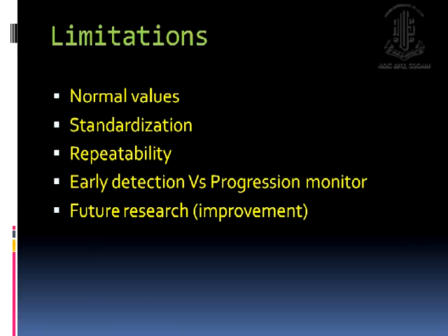There are some limitations in general for the multifocal testing. Number one is the normal values. There's a big range of normal values, even centrally and peripherally. That's why it's a little bit more difficult to standardize the test. All that's available now is guidelines from the ISCEV, and it's very hard, theoretically at least, to standardize all the data. There is a range of accepted amplitude and latencies, considering that this is an ERG waveform at the end. But in order to standardize it to that extent and make certain limits, we are still a little bit behind.